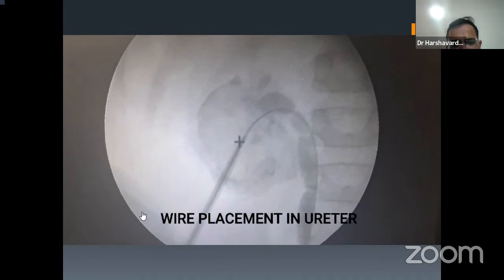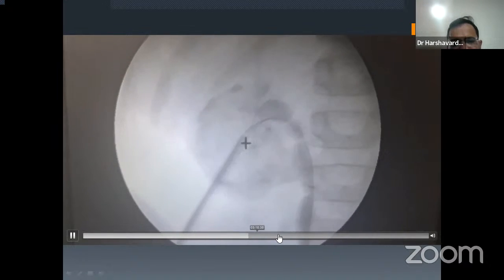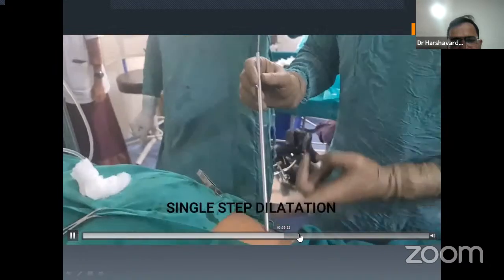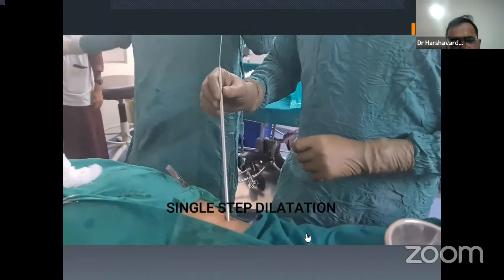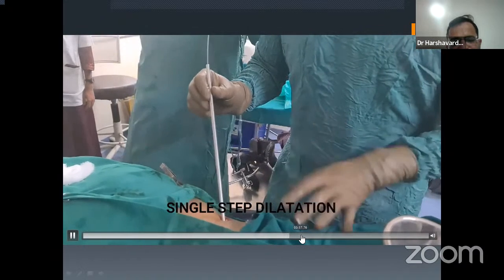Screw dilator. Gently, once this is done, we try to dilate with single step Shah's dilator, using an 18 French Shah sheath. So we are doing a single step dilatation here.